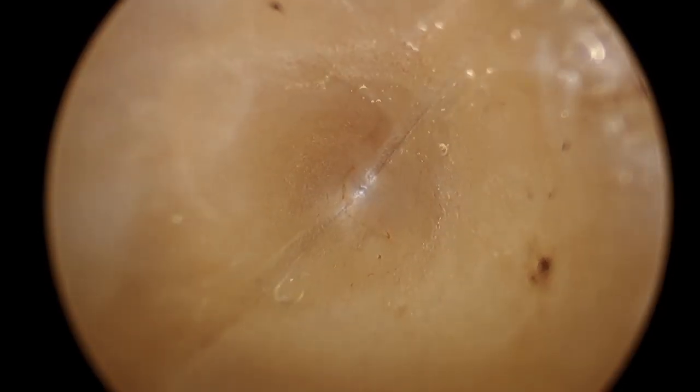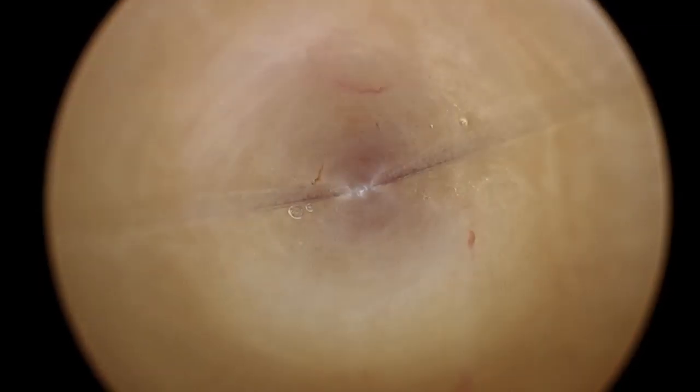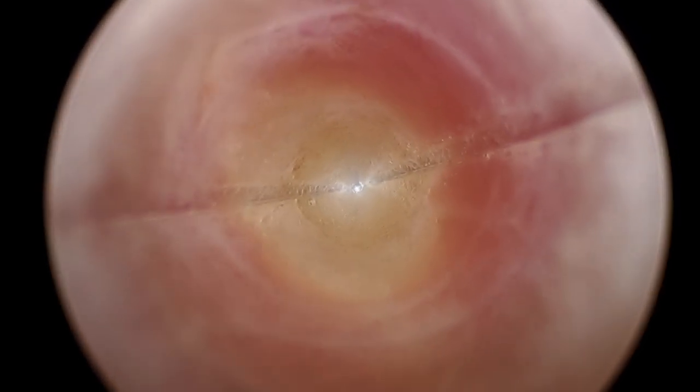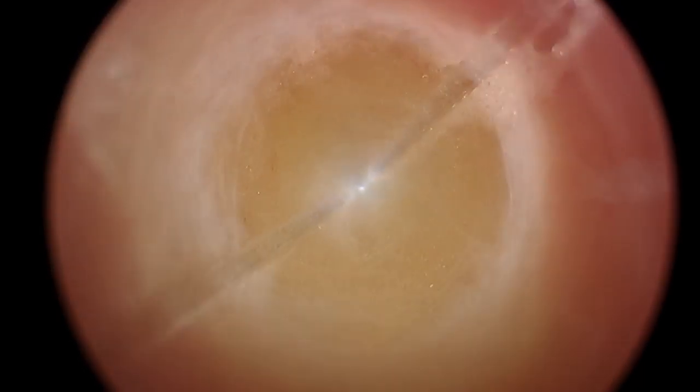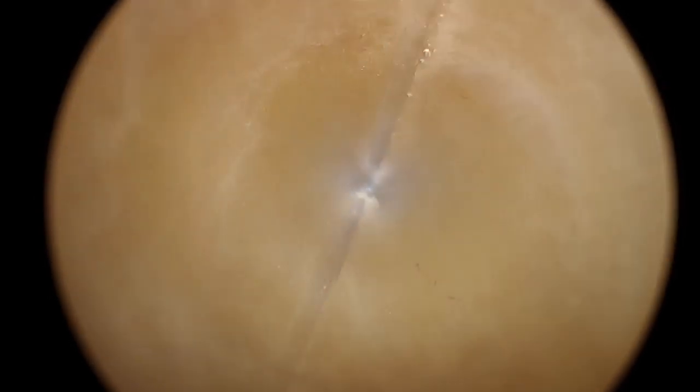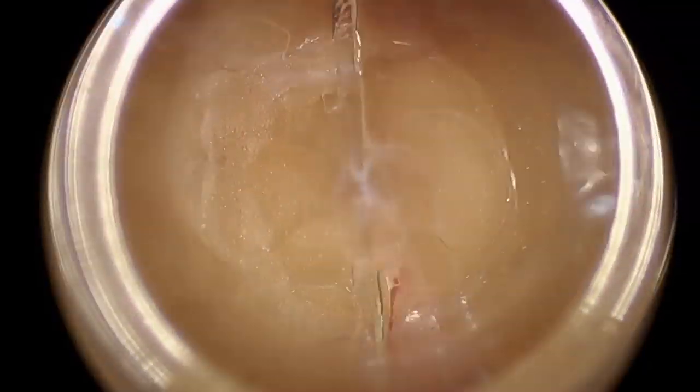After the patient has been positioned supine with arms out and an orogastric tube is inserted after intubation, we begin the procedure by making a small stab incision in the left subcostal region and inserting a Veress needle. After insufflating to 15 mmHg, we change this out for a 12 mm port placed using an optical trocar.